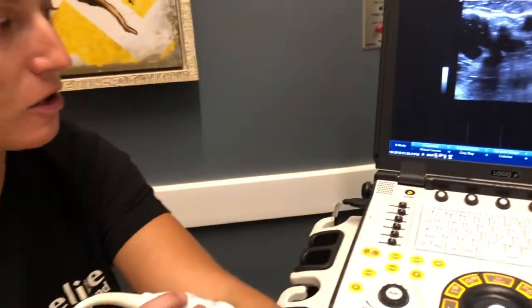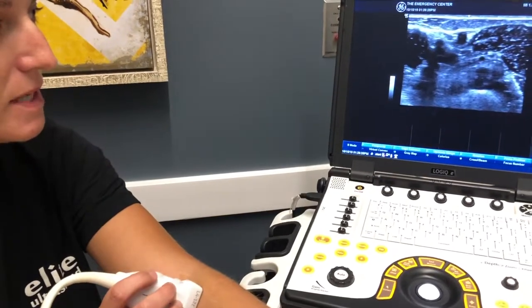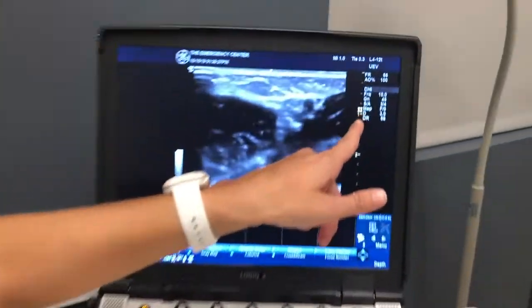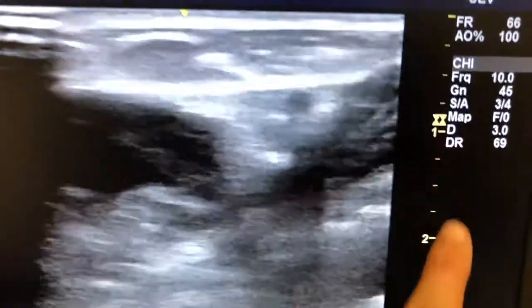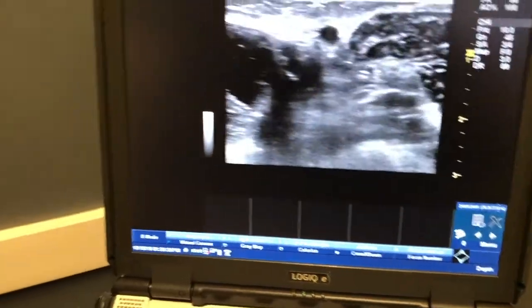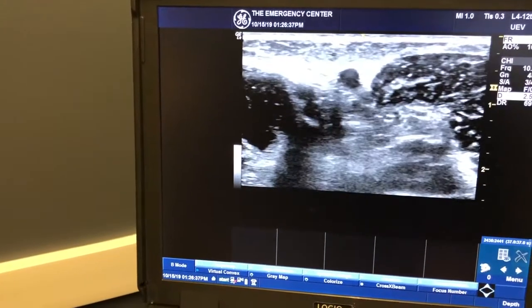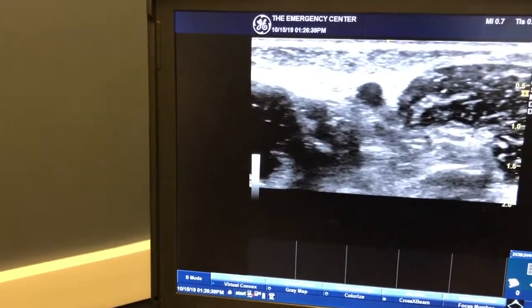So then you'll know that vessel right there is about 1 centimeter depth. If you look right here, there's your 1. Those are in centimeters. And so at that point, you can change if you want to. Yep. Make it even. There you go.